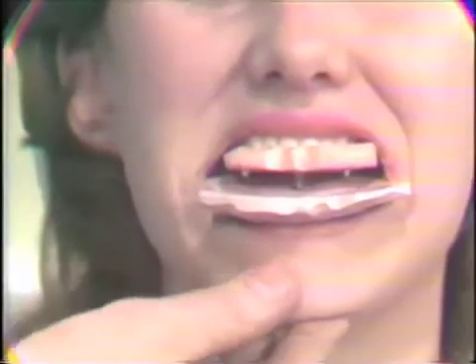Okay, bite together. Whoops. Okay, what we'll want to do now is have the patient move forward and back, to the right and left, and go through all our border movements. Okay, back, forward again, back.